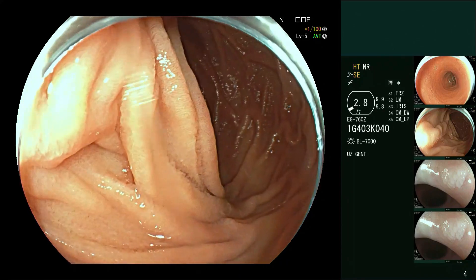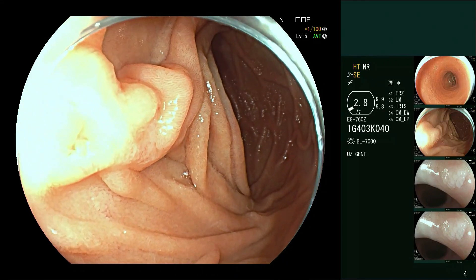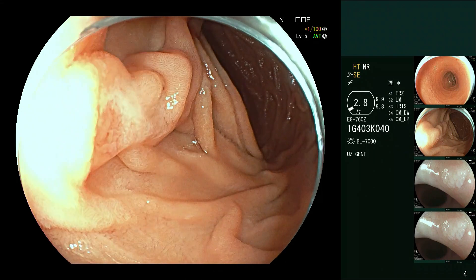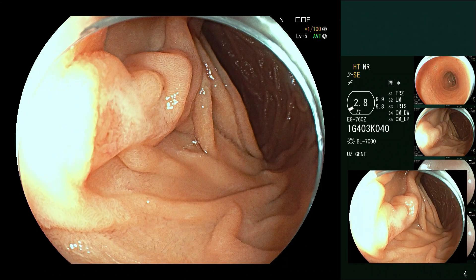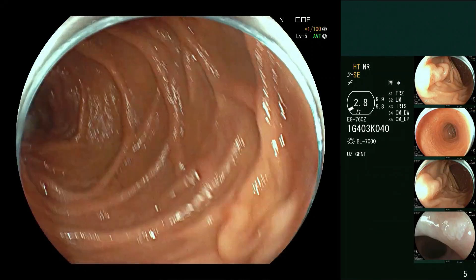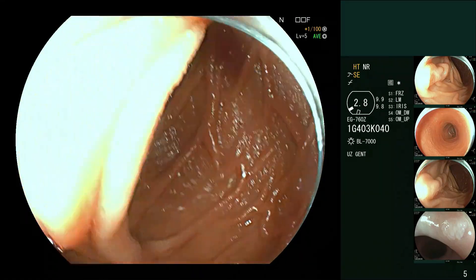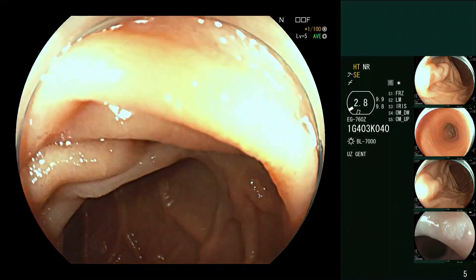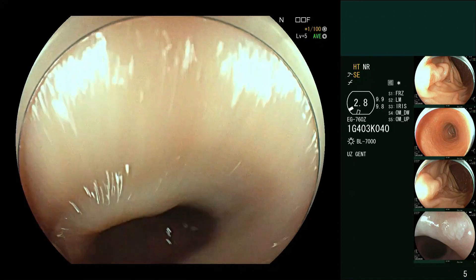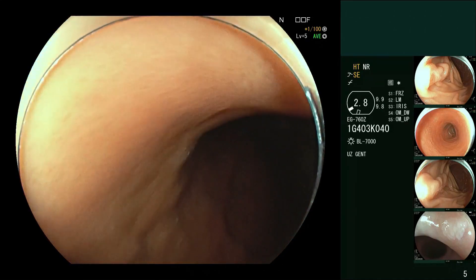We've achieved it by pushing in with a long form technique. A little bit of the light reflex is annoying, but if we push off a little bit more, there you can see the major papilla — not really in the standard anatomical location, but not bad. The minor papilla will be up here at 12 o'clock; it's very rare that you can see it unless it's dilated or otherwise abnormal.